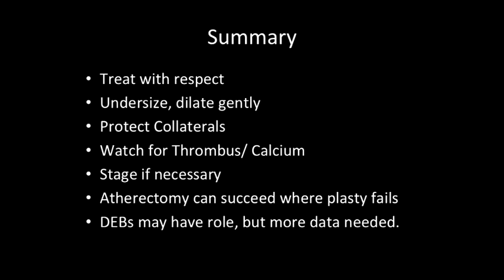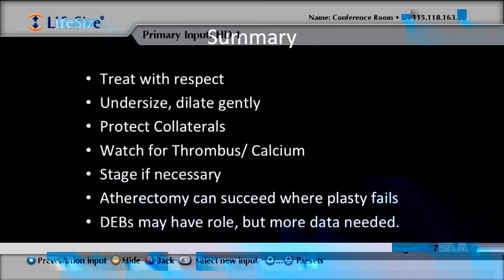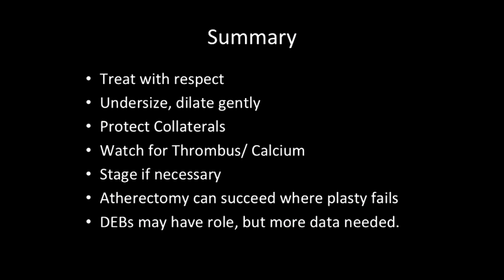Now what we are doing is, over the balloon and the wire, we are taking the guide catheter up. We have to be very careful, because if you somehow engage the stent with the balloon, you might have a problem there. That's why the guide cath is being taken up, and this is a difficult process, a stiff device being taken up. Now you can see that there is definite improvement in the caliber.